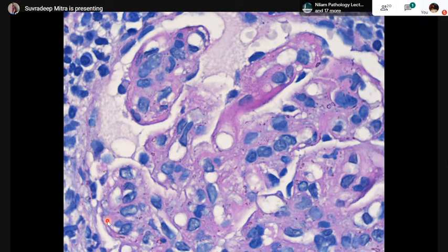So this must be a disease which has of course progressed for quite some time. It cannot be an acute disease. It must have caused glomerular remodeling. It cannot be an acute disease. So in our mind, post-streptococcal glomerulonephritis really becomes lower down the card, because it's not really an acute glomerulonephritis. You can see the nice splits over here.